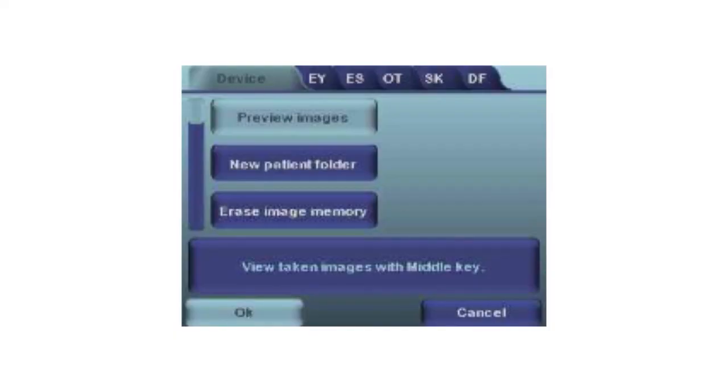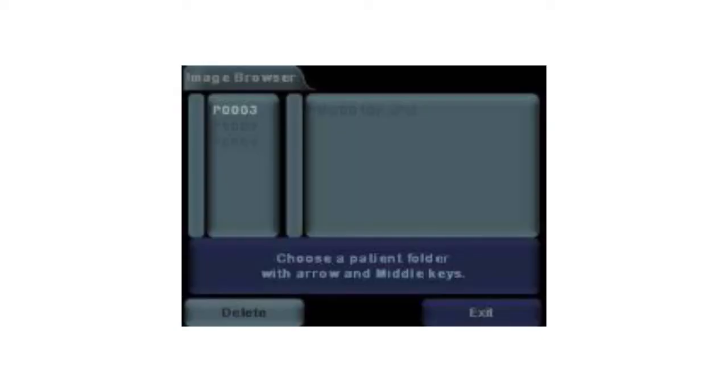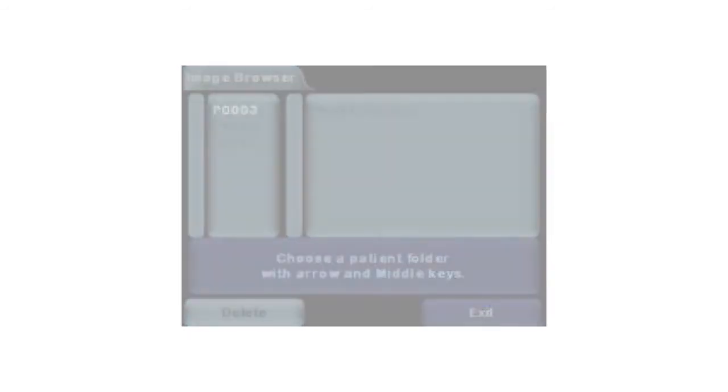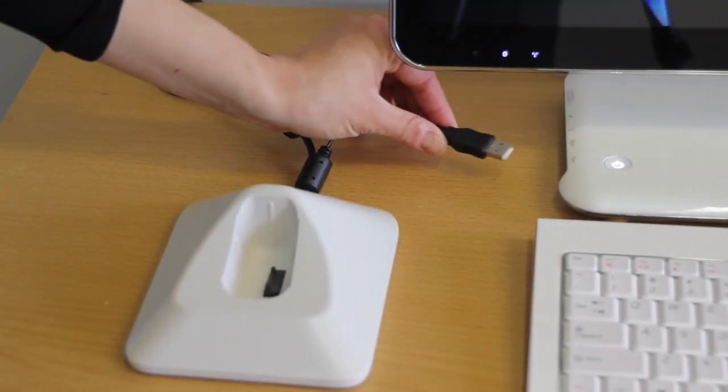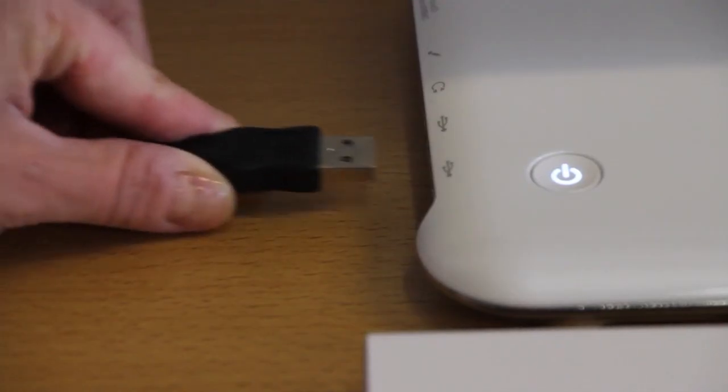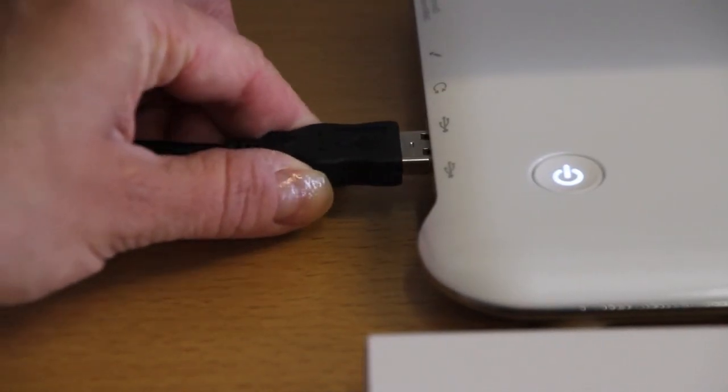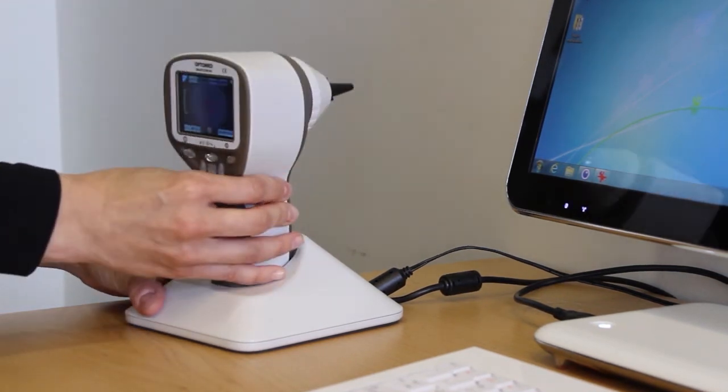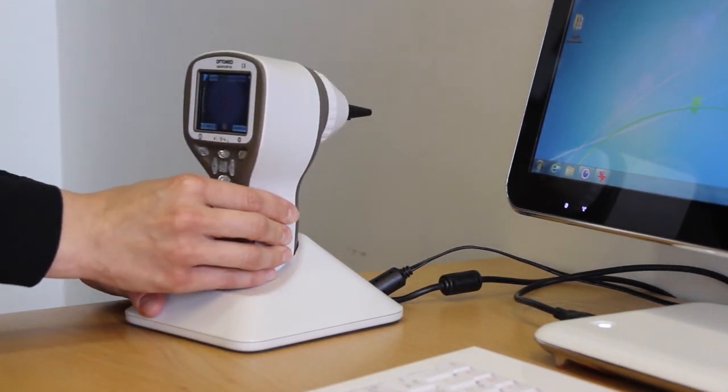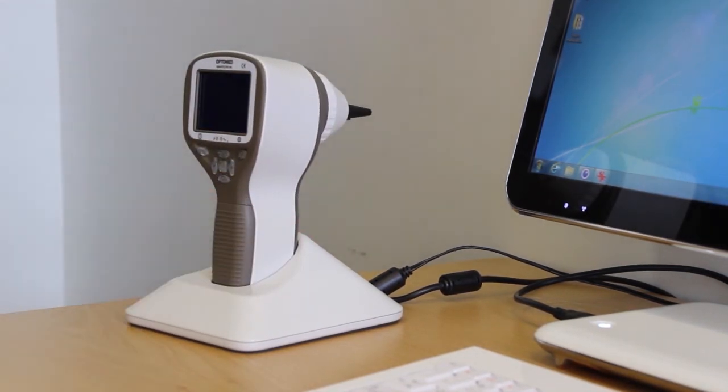If you want to preview images, go to the device menu and select preview images. The most recent image will be at the top of the file folder. Images are uploaded to a computer by placing the camera in the cradle. Image transfer works through USB connection in a similar way to any other digital camera.